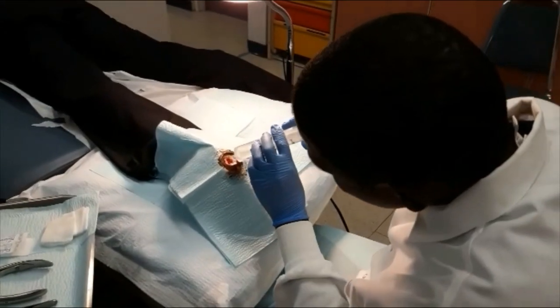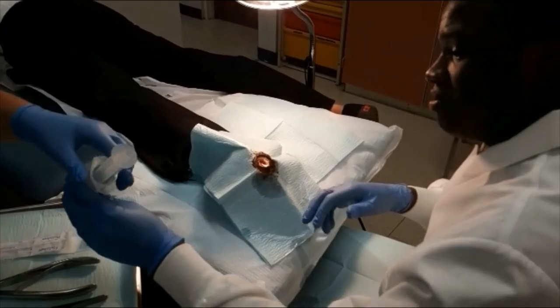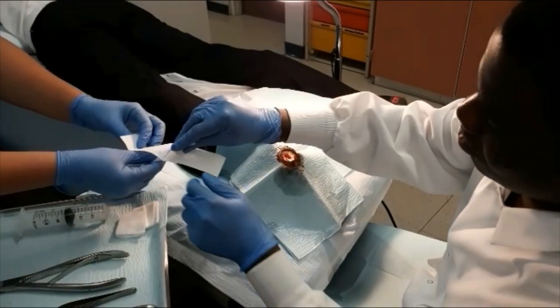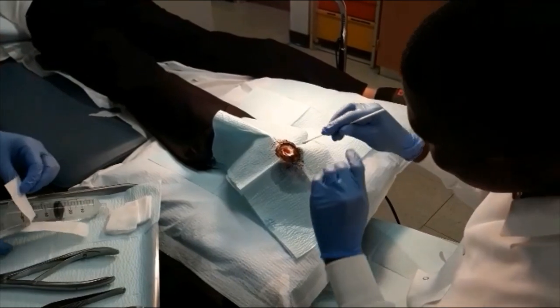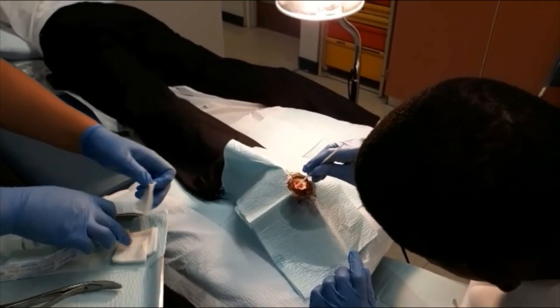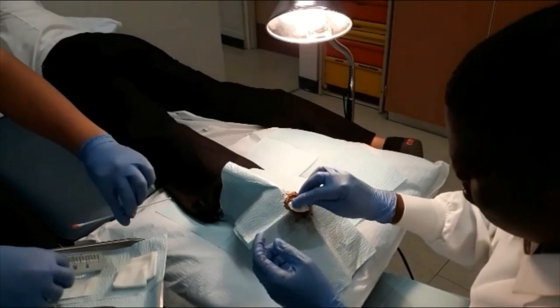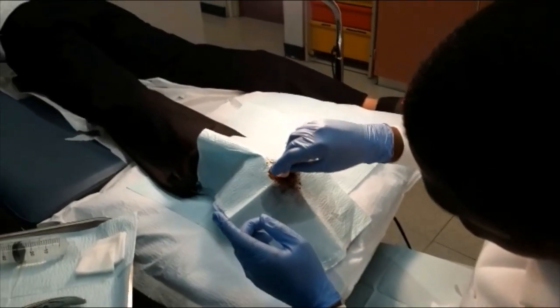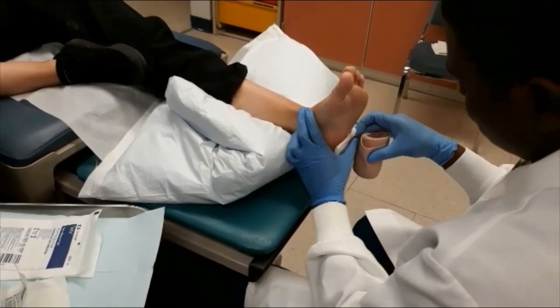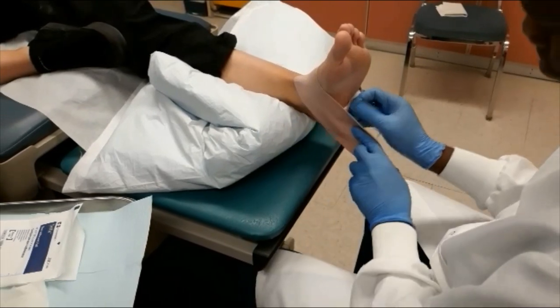Once the physician finishes with the removal, cleaning of the open wound is performed using a syringe with sterile water, a cotton tip applicator, and gauze. After the wound bed has been thoroughly cleansed and dried, a non-adherent pad and absorbent gauze pads are placed over the open area. Finally, the foot is bandaged.